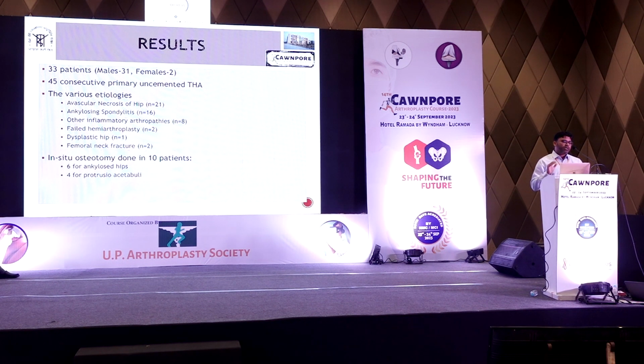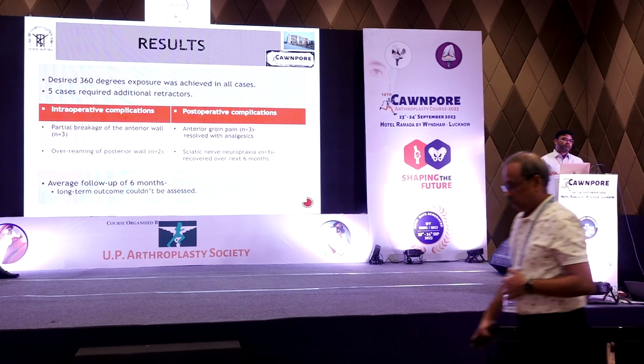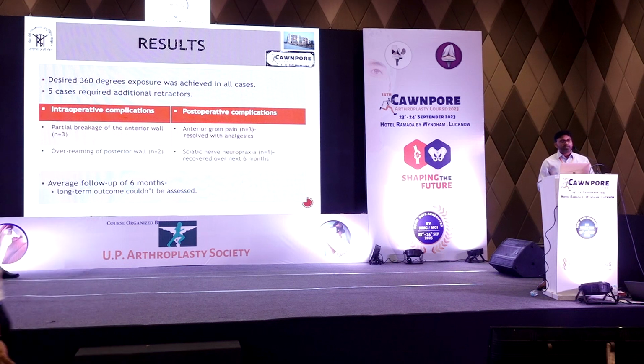I have a very low threshold for doing an in situ osteotomy because I do not want to fracture the posterior wall or the femur. So I did in situ osteotomy in 10 patients, 6 for ankylosed hips and 4 cases of protrusio acetabuli. So the desired 360 exposure was achieved in all our cases. However, in 5 cases, we had to use additional retractors. Most often, we had to use an additional retractor on the postero-inferior aspect.